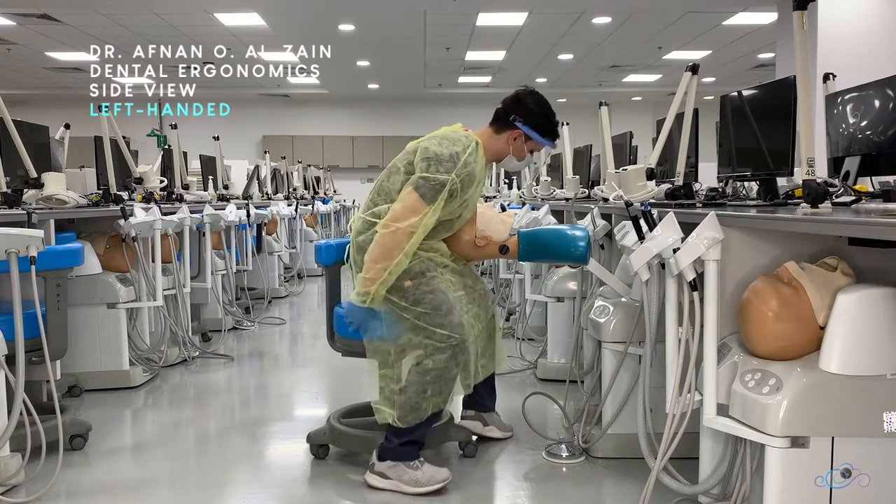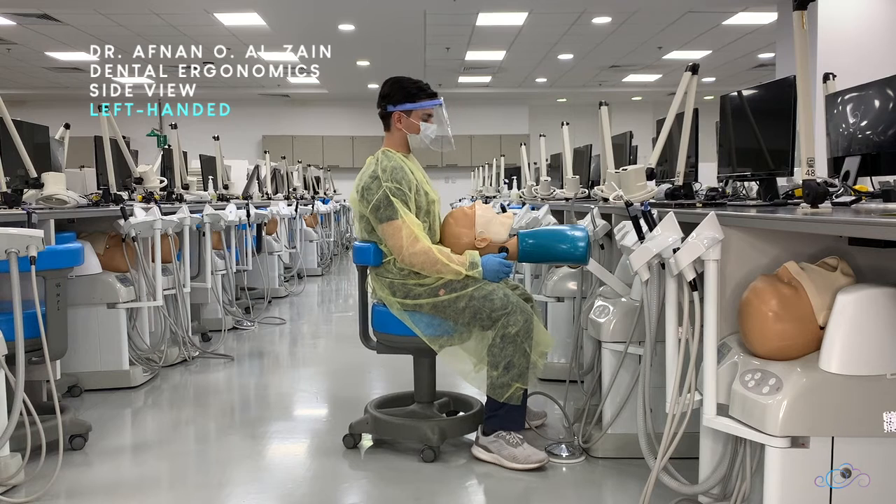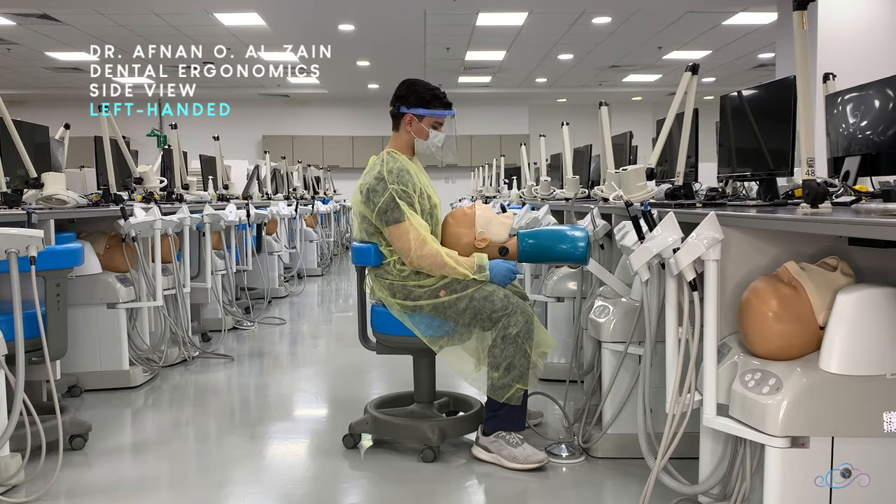After wearing the PPE, you're going to sit in the chair, place your foot flat on the floor, 90 degrees with your leg and your knee, 90 degrees with your thigh, and sit back as much as possible so your back is touching the chair and your back is straight with your shoulders back.